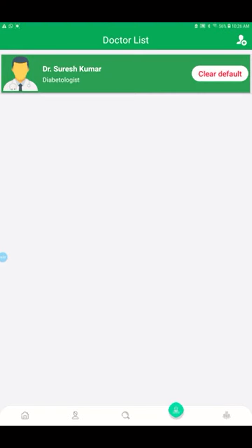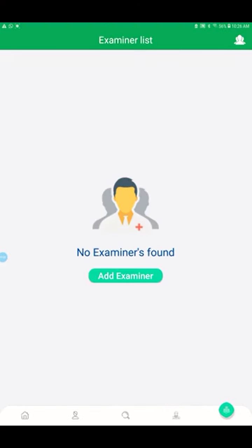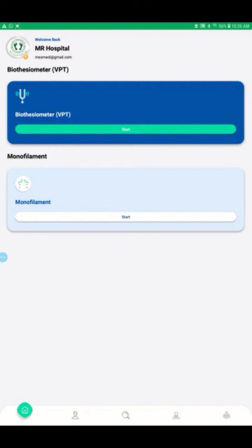Okay, so the last one is the technician examiner name. Some hospitals have a habit of having the technician name. So it's up to you. If you want to add, you can add the technician name, otherwise you can leave it open. Okay, so now we are done with everything. I'm going to the home screen.